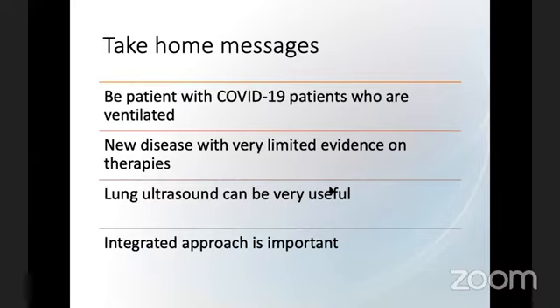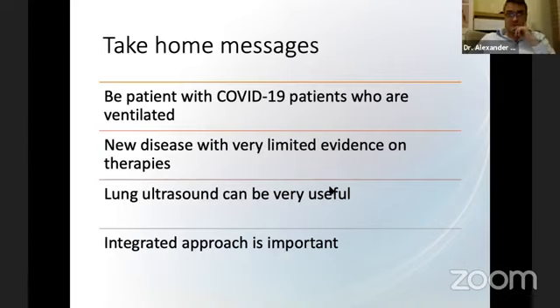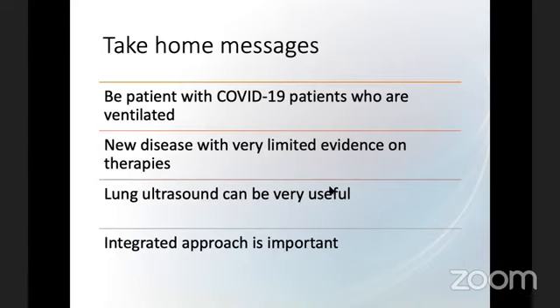So, question from our colleague, Dr. Fadi Aziz. He thanked you for your great lecture, Dr. Hatem, and he is asking if you recommend increasing PEEP levels up to 20 centimeter water in the H type for further recruitment of the lungs, if they are on FiO2 80%, or would that reduce the venous return?